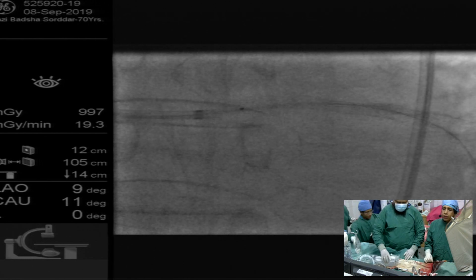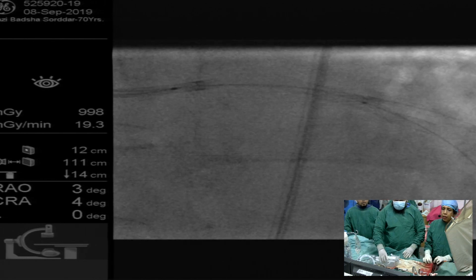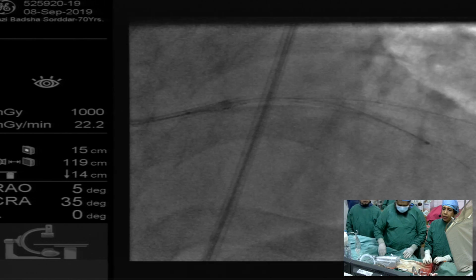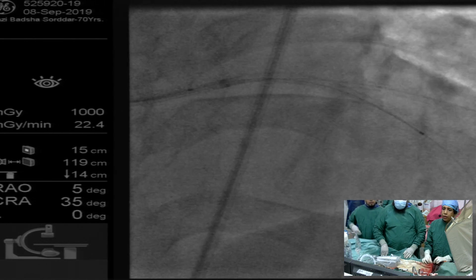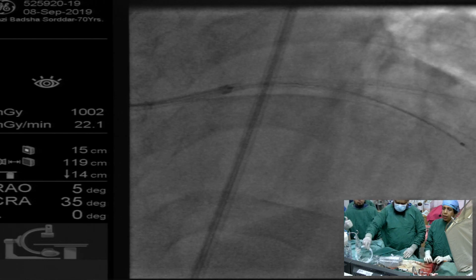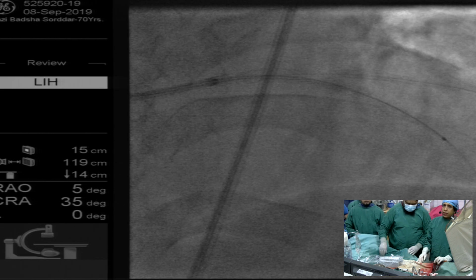So getting it in might be a bit of a challenge. So the second marker is the camera, and we have crossed. We're good, right?